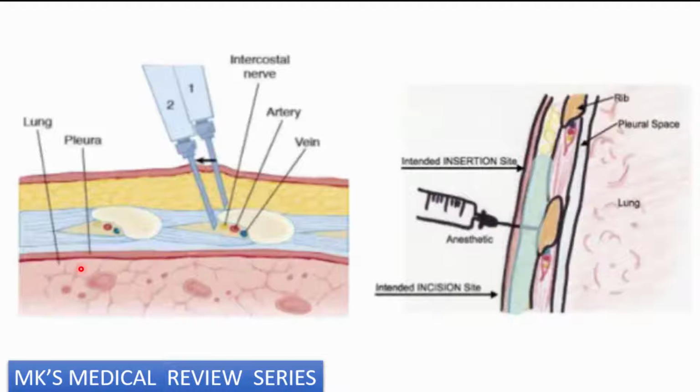So as you can see here, you have the lungs, you have the pleura here, and you have the different muscles, you have the neurovascular bundle. As you can see here, you're going towards the rib and anesthetizing the periosteum. You're going over the surface of the superior rib. So you're assuming that, of course, this is your sixth rib, and this would be your fifth intercostal space. So you're going over the superior surface to avoid these neurovascular bundles.